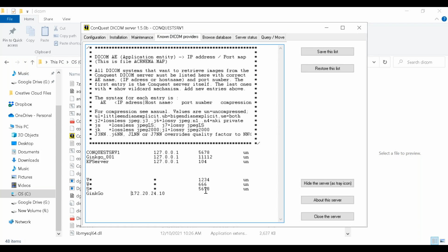Spaces are important. You want to make sure that you tab. Notice how I tabbed and made sure that it is in the column. That is the finicky nature of this program. It wants you to put tabs in there, right? So just keep that in mind when using this. I'm going to give it a port. Let's give it a different port, 2221. Why not? Because it's different from the one I entered earlier.